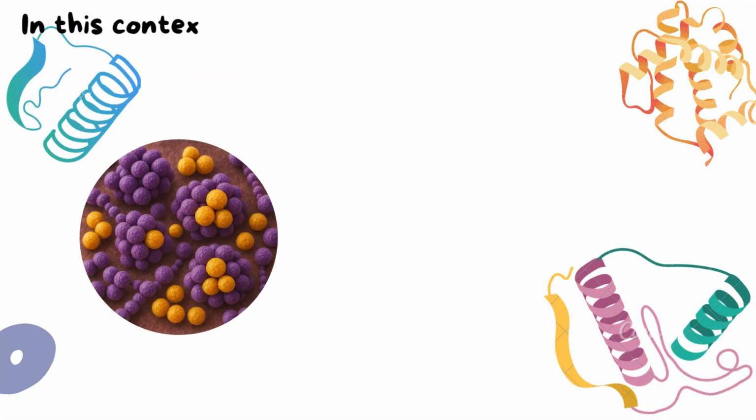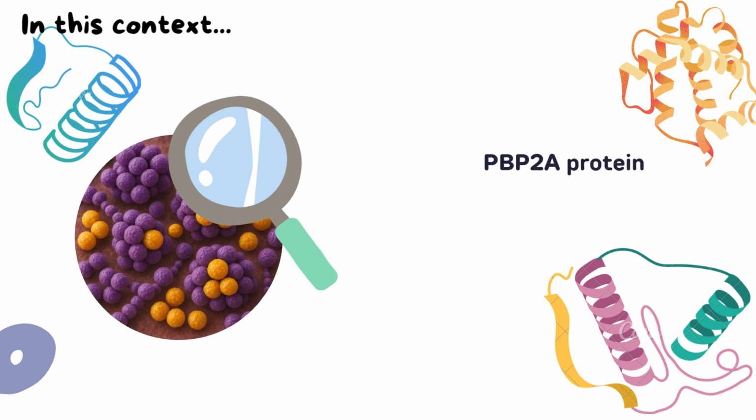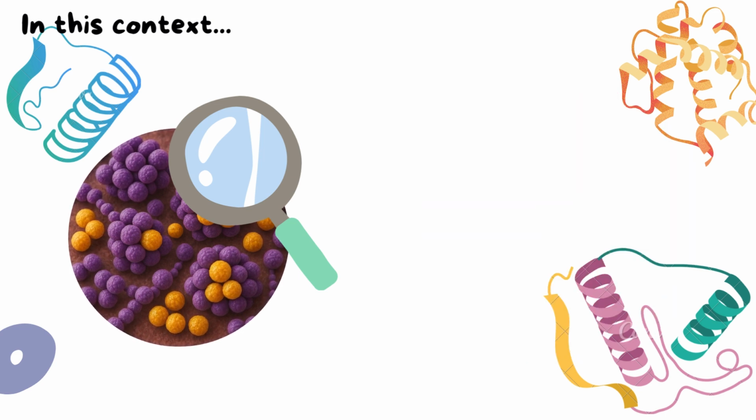To detect MRSA, we look for specific molecules associated with methicillin resistance. While the crucial PBP2A protein itself or its fragments are not typically detected by this specific method, other important molecules found in many MRSA strains can be.